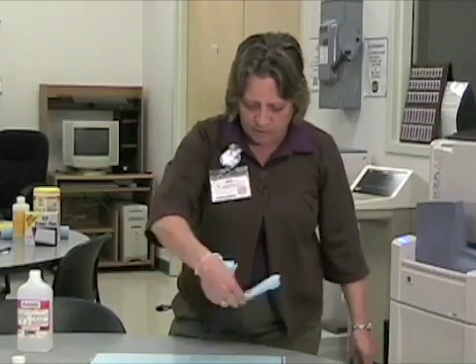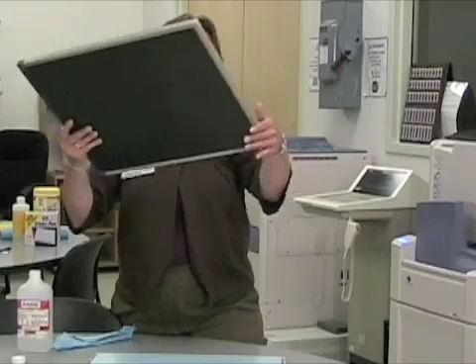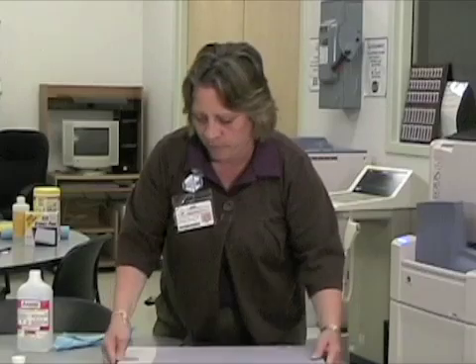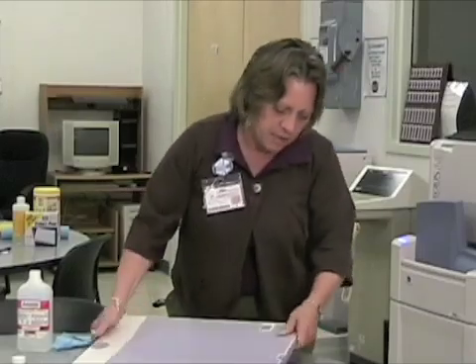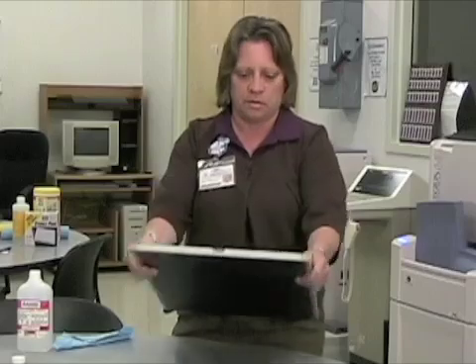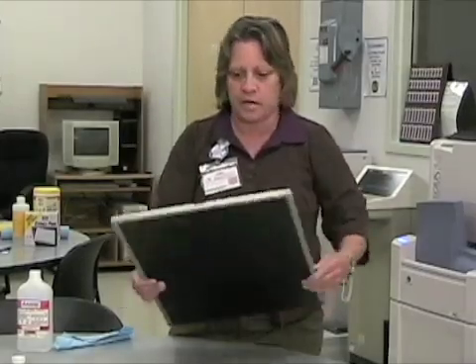Give it just a second to evaporate. Then take the cover and put it back on. Hold the latch down until it latches tight. Make sure that it's latched tight before moving on.